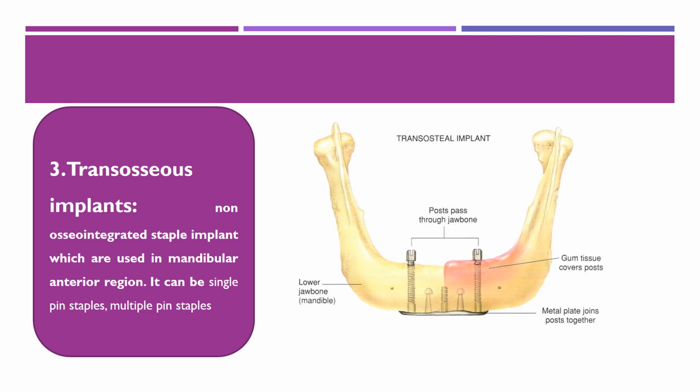Some of these implant systems were initially stable and appeared to be successful over short time periods, but failed to remain stable. They became symptomatic or loose and failed over longer periods. Lacking predictability, these implant systems are not used. Currently, mostly endosseous implants with a cylinder or tapered screw type threaded design are used nowadays.